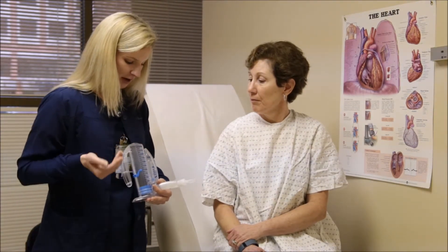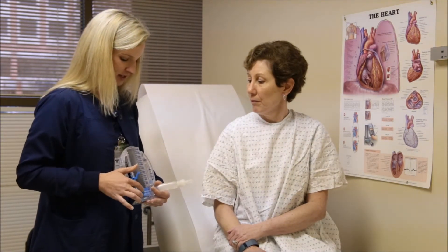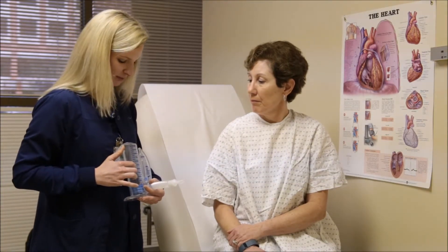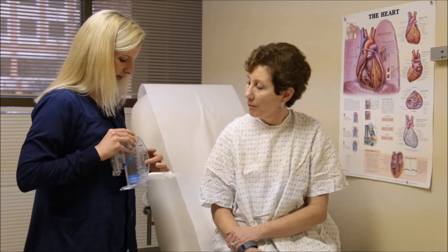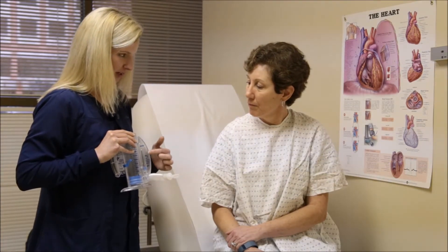So how you use it is you take a deep breath, and what will happen is this indicator will rise slowly as you take a deeper and deeper breath. Your goal is to take a nice slow breath and it keeps this little bead right here in between these two arrows to tell you that you're going nice and slow.